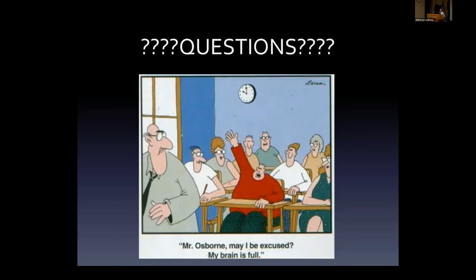What's around the smallest size vessel you can get into these days? Usually we'll target an M3, and when we start getting out that far, we like to see a perfusion deficit. Obviously it has to be clinically relevant, right? And most of the time those patients may not be candidates for TPA. But yeah, we've gone as far as M3s, and there's a growing body of literature that this is not only safe, but very, very effective.